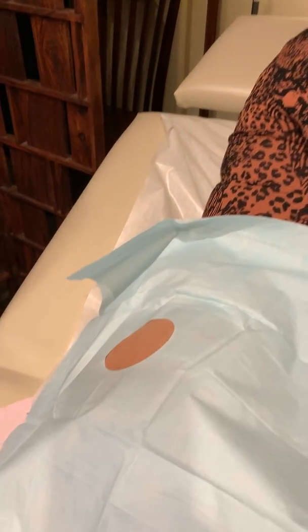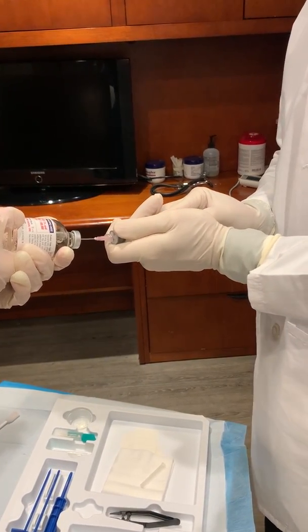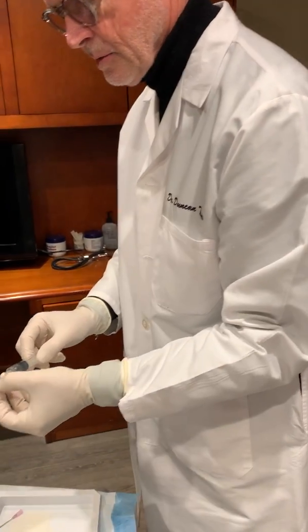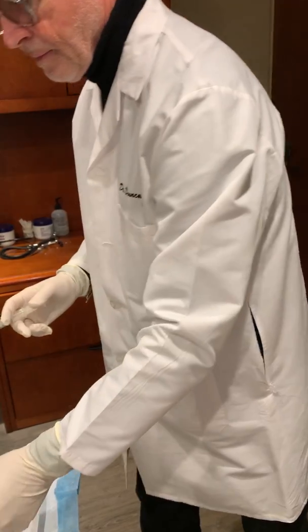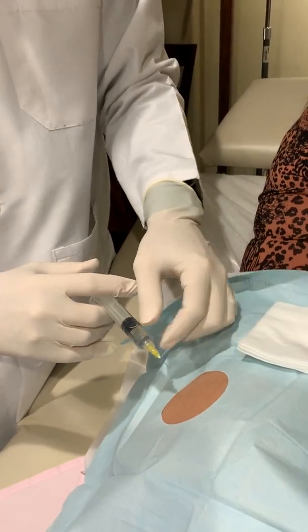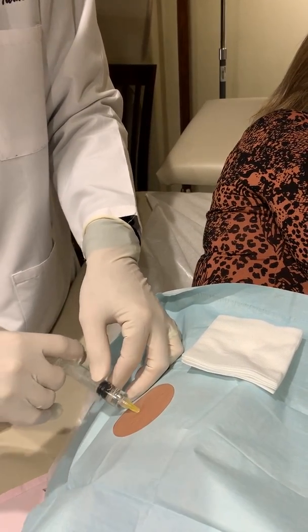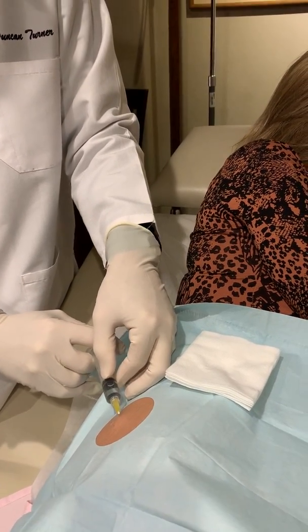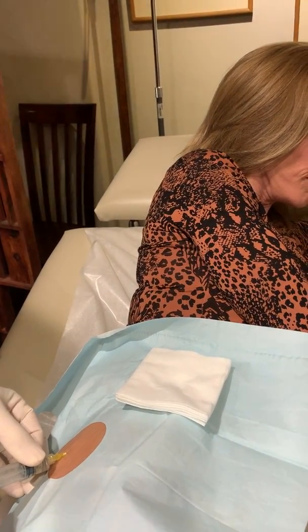We're going to use some local anesthesia here. Two or three cc's of 1% xylocaine is usually all we need. We use a tiny needle to insert it — it's a Botox needle, the smallest we have, a 30 gauge needle. You're going to get a little stick and stinging here. We're going to put this in subcutaneously, so we've got to create a little bit of a space. Lisa has very, very little fat tissue here so we've got to make sure we get good placement.